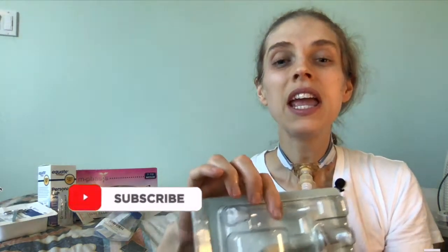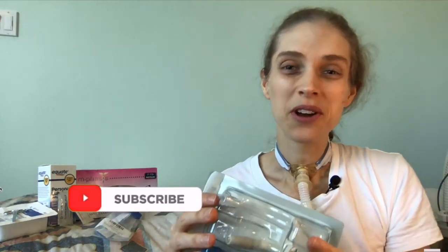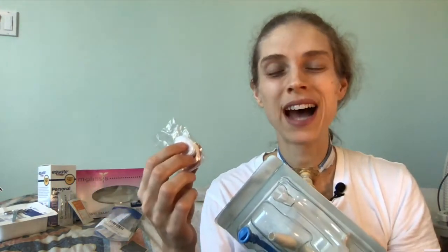And there might be a few other things, such as this clear inner cannula, which looks like this. And it might have a few other odds and ends, such as a trach tube tie inside. But remember, this is a sterile container and do not open it until you're ready to do the tracheostomy exchange.